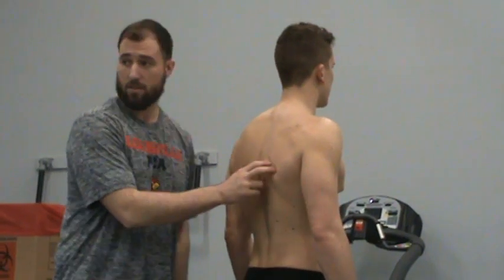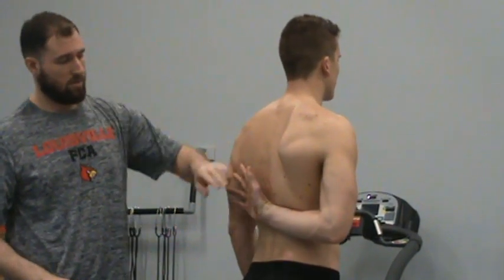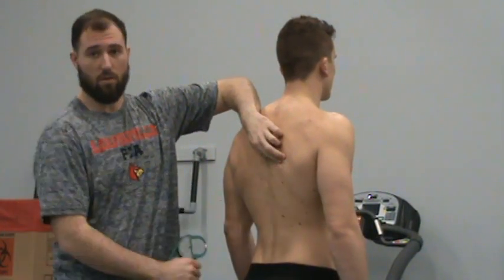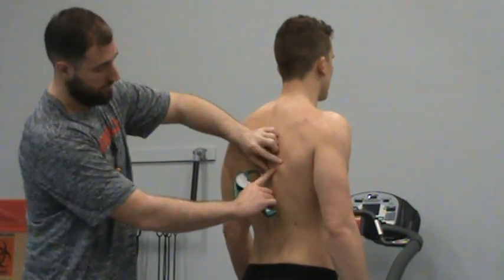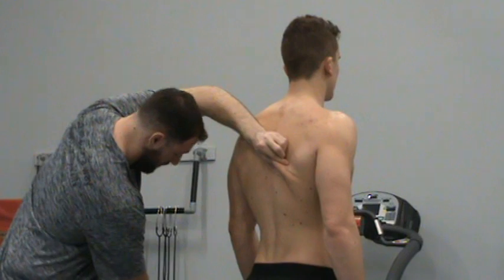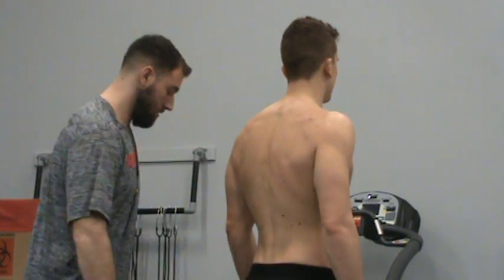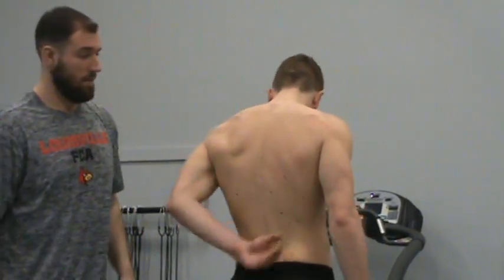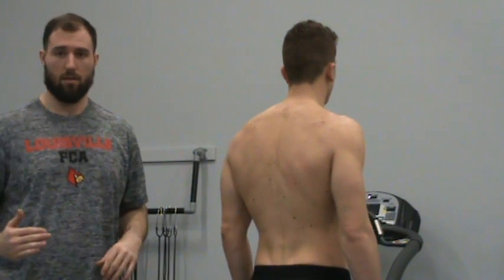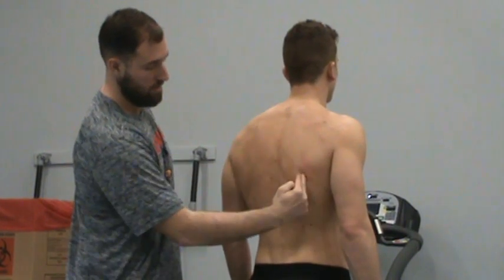Then he's going to turn around. I'm going to do the subscapular here — this is going to be a diagonal fold. I find where his subscap is, and I'm going just about a couple of centimeters below that. I usually use about a thumb's width here. I'm going to get my big pinch, get my calipers, and I got a 12. With diagonal folds, you always want to make sure the fold is going with the way the muscle is going. So I pinch this way so the fold should be going where his muscle is going.